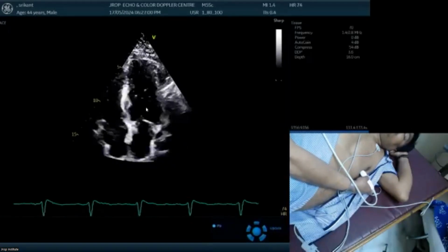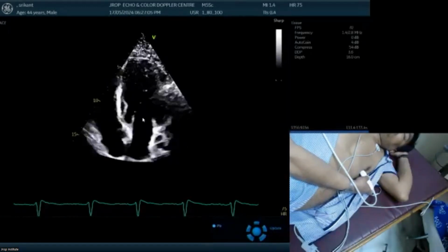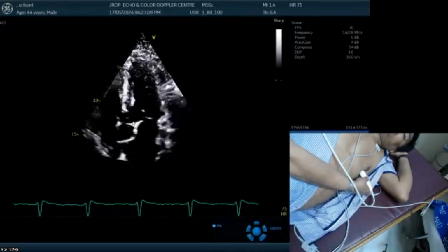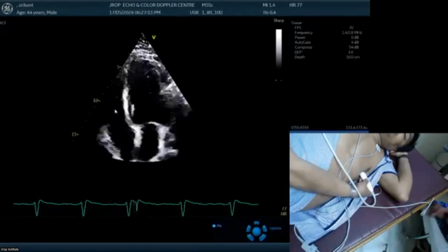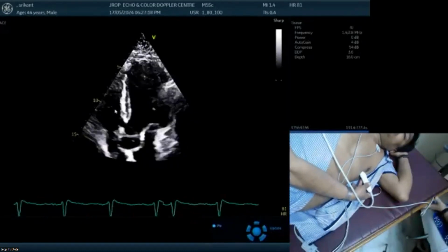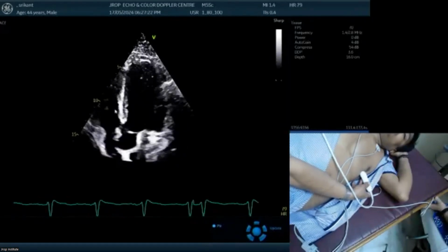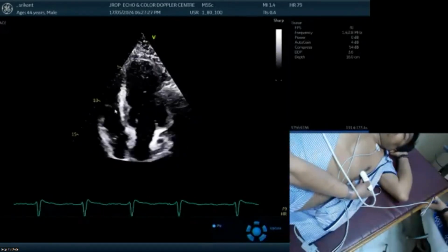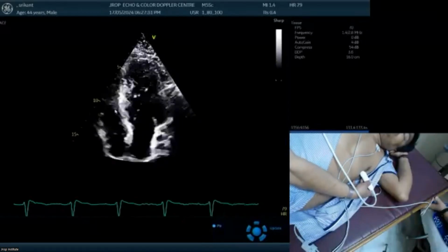And now you can see this is septum, this is lateral wall, and this is anterior leaflet, this is LA, this is LV. Here is an aorta, here is RA, here is RV. And look at the movement, I'm taking away my hands. This is left fifth intercostal space. If my footprint starts looking towards aorta, the aorta opens. Otherwise, footprint getting away from aorta, the aorta closes and becomes four chamber.